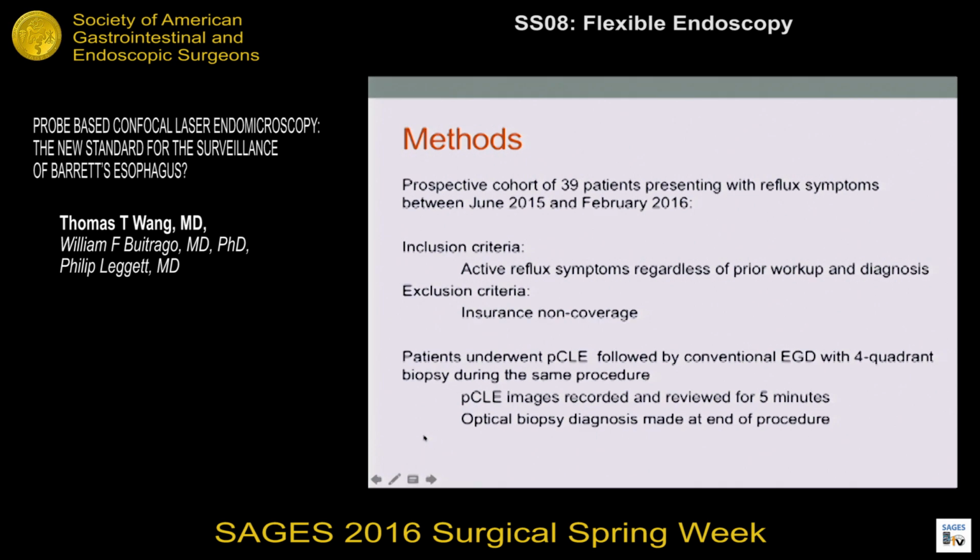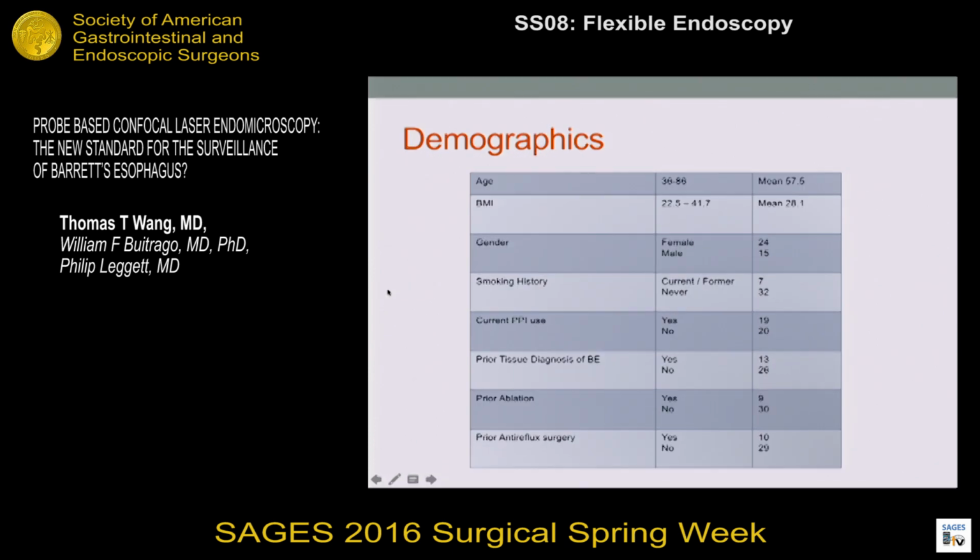I want to add that every patient in our study that underwent PCLE also concurrently underwent EGD with 4-quadrant biopsies during that same procedure. Optical biopsies were used to make the diagnosis at bedside, before any of the pathologic tissue biopsy results came back.